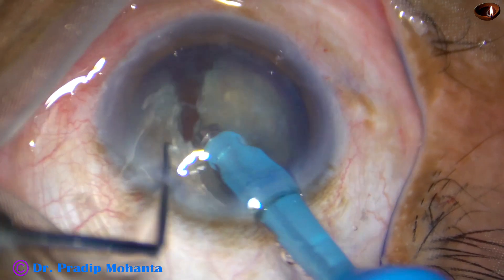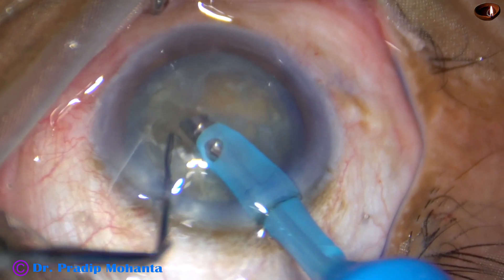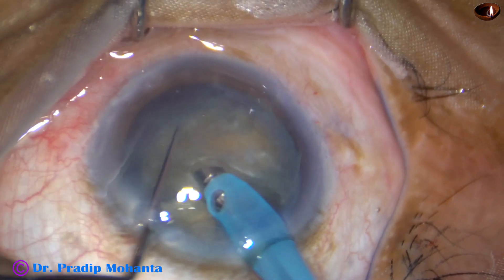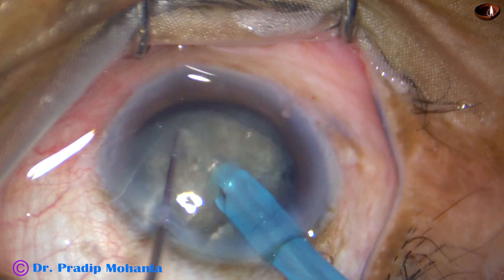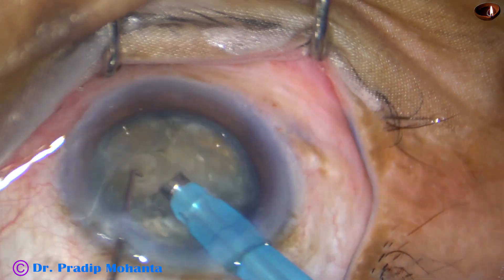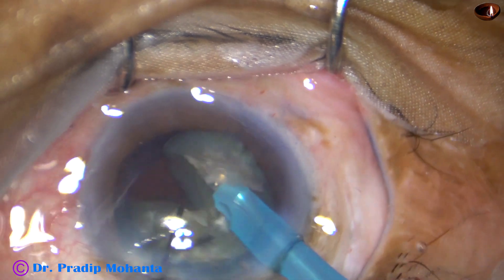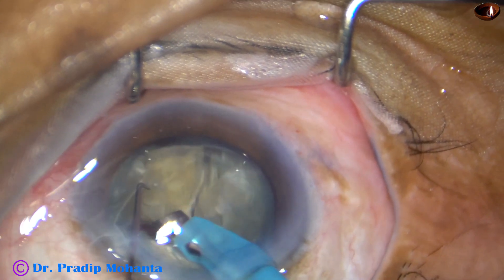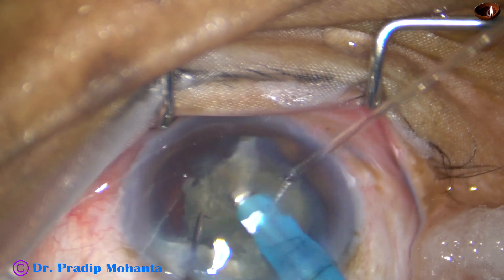And now I rotate this nuclear mass 180 degrees, hold one hemi-nucleus with vacuum and separate the two hemi-nuclei completely. Now each hemi-nucleus is again divided. Again I go through the substance, hold it very firmly and then chop it. And now I rotate the whole mass. I am going to divide this piece into two smaller fragments. And now I emulsify these smaller pieces.